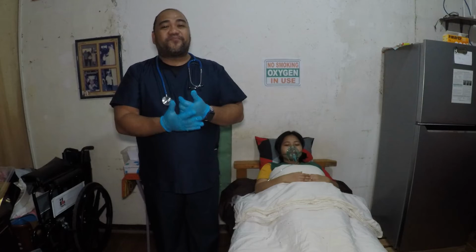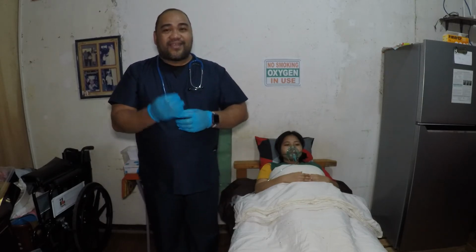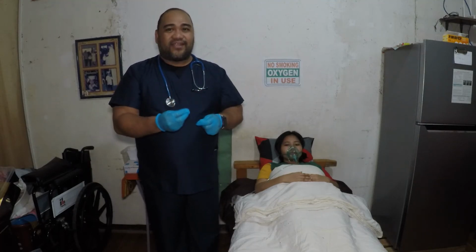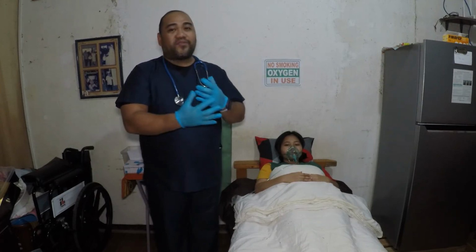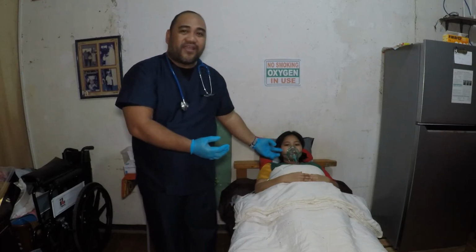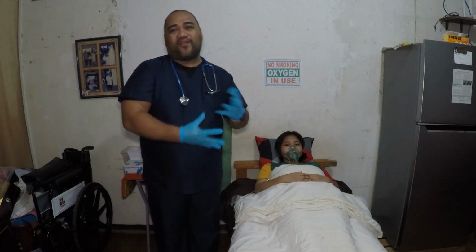So one of the most important things is, when you use the simple face mask, the administration of the oxygen is really high compared to the nasal cannula. But when the client is going to eat, you have to remove the face mask, then clean it, and after eating, you have to put it back.